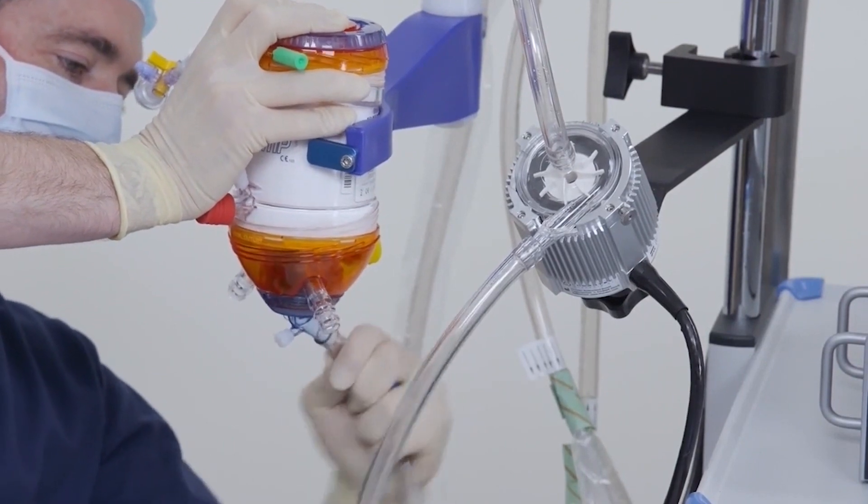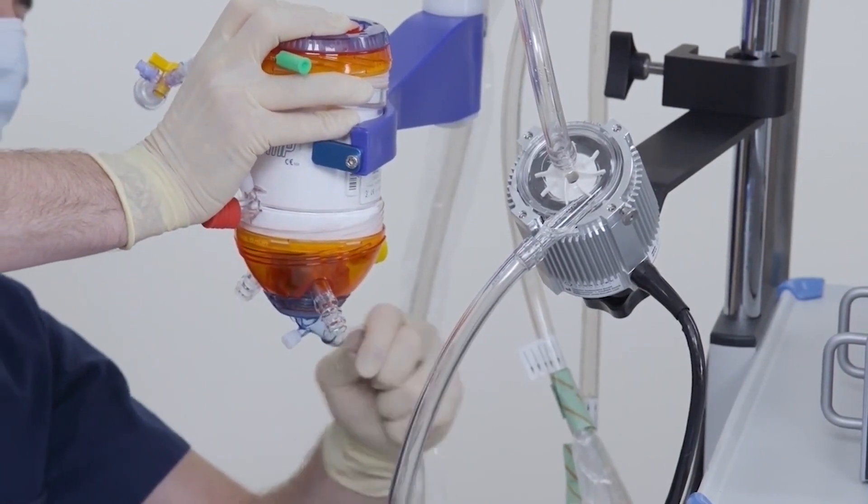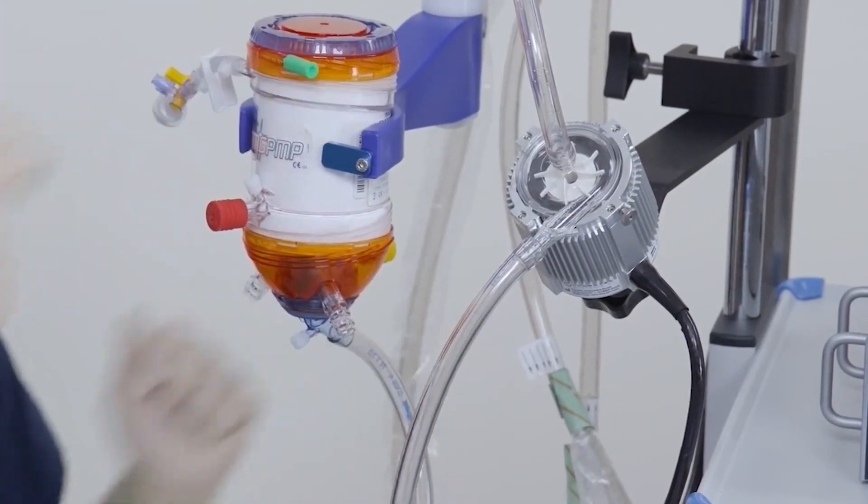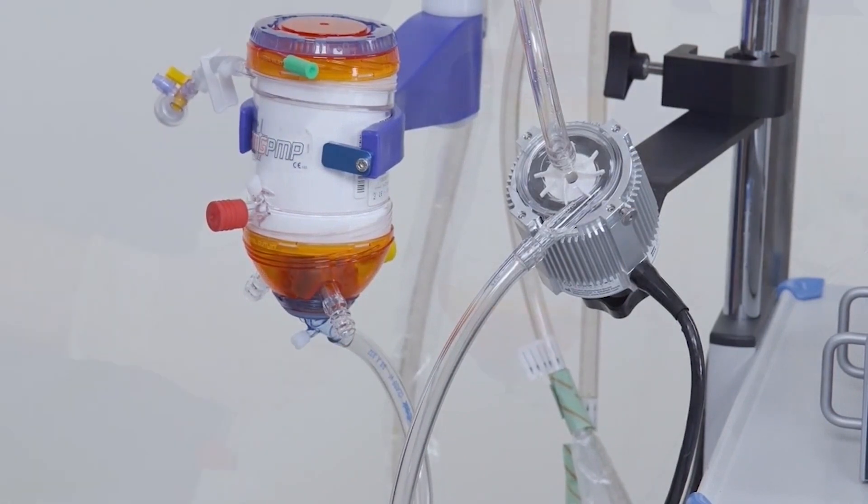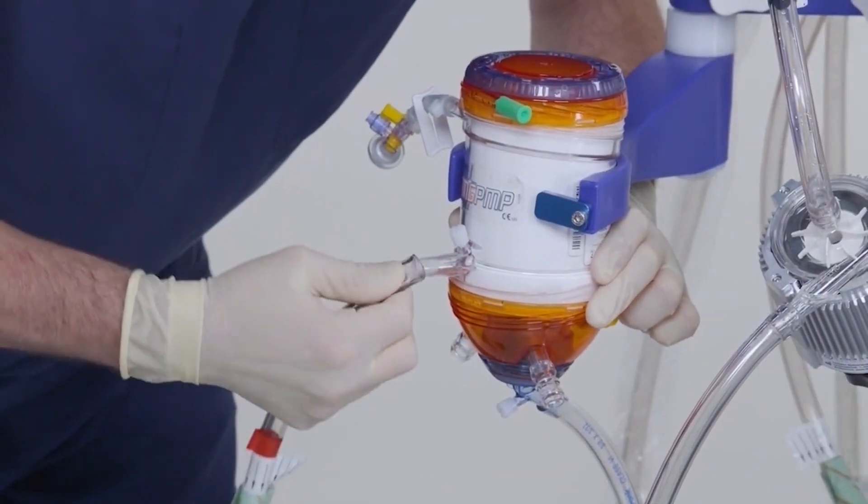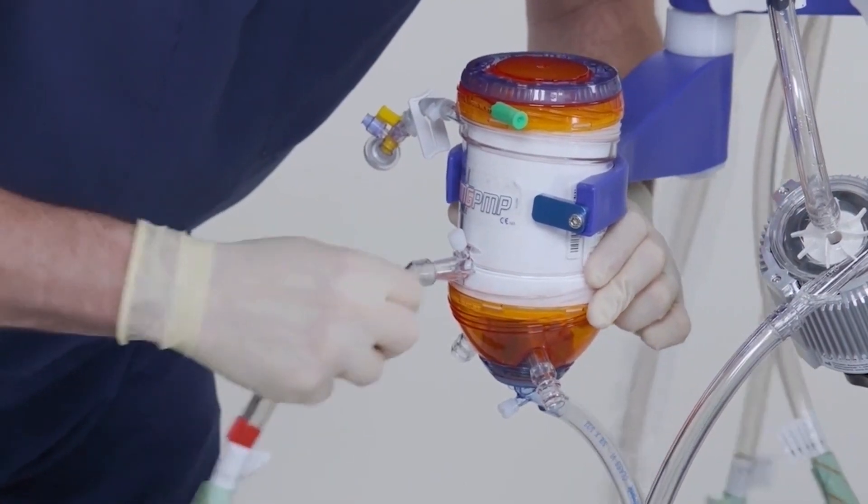Next, connect the other end of the tubing to the blood inlet port of the oxygenator and attach the arterial line of the tubing pack to the blood outlet port of the oxygenator.